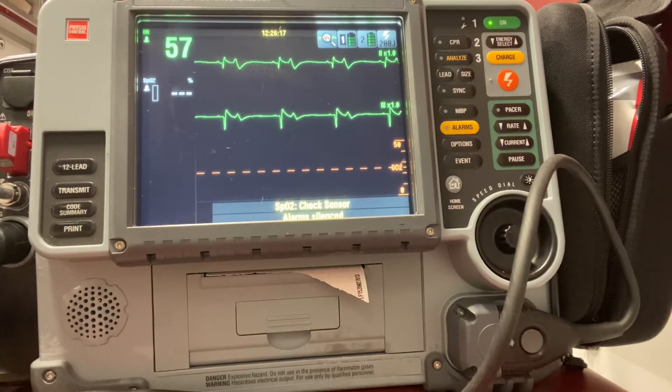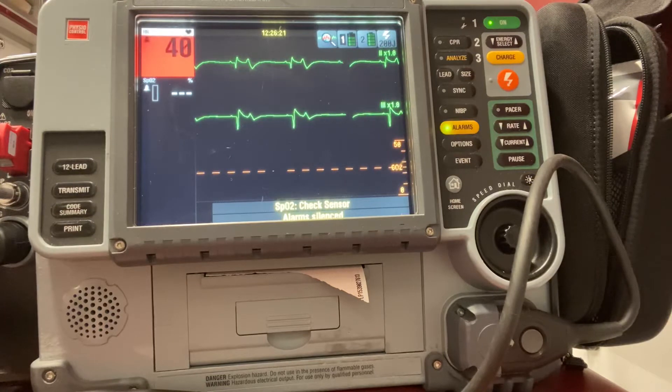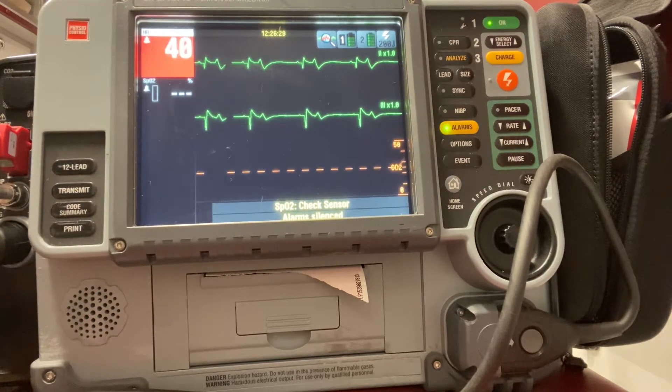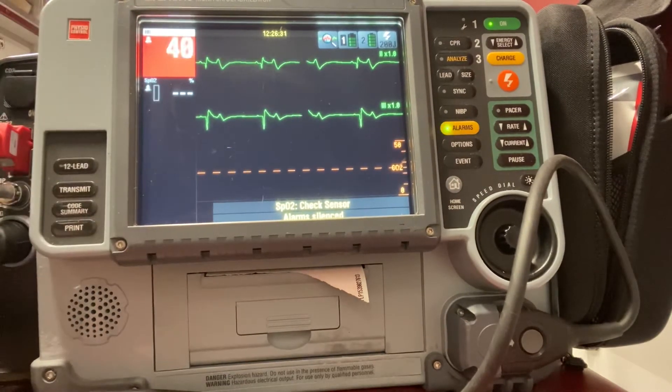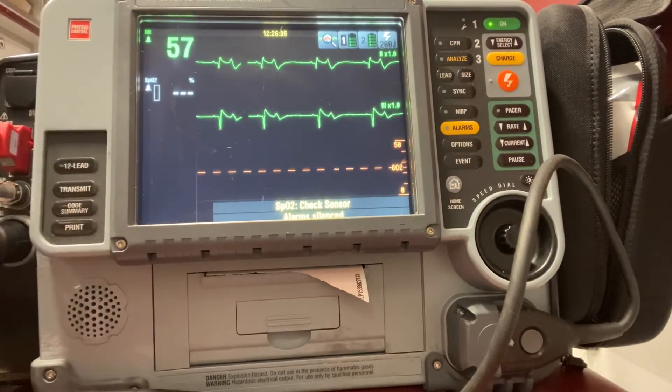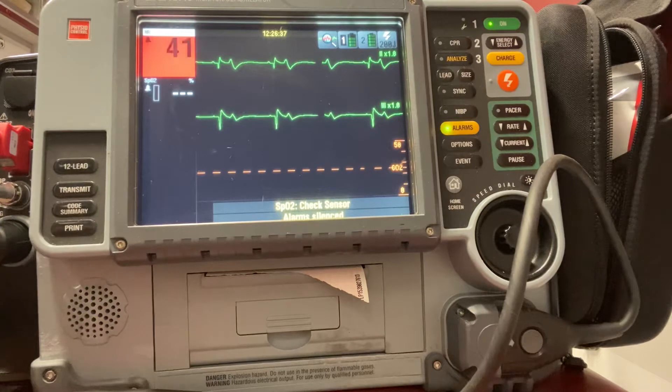If we can't access our patient's back, we could always do the front of the chest and the side, like we typically do for our AEDs. Here I have a patient in sinus bradycardia at 40 beats per minute. We're going to say that this patient is unstable due to their bradycardia and they need transcutaneous pacing.